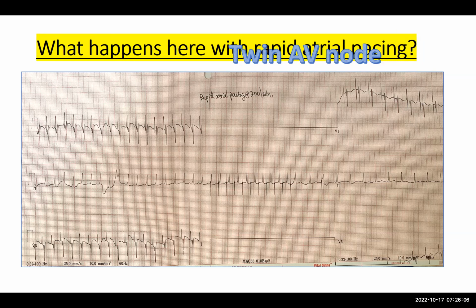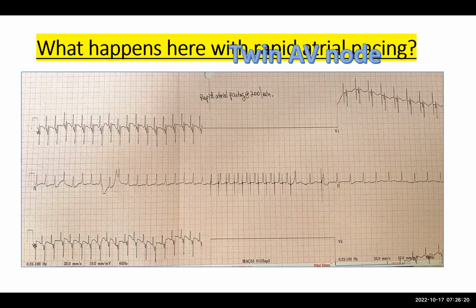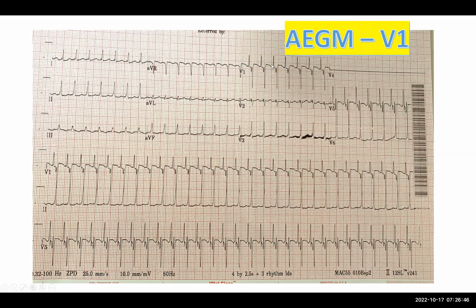Slightly slower, and QRS looks about the same. The PR interval looks different. So this is a reentrant arrhythmia, right? Because pacing should not be able to terminate an automatic rhythm. So this isn't sinus, which it could have been, except we know that it started suddenly. And what we theorized, in retrospect, if we go back to this tracing, is that there is a very long R to P interval here. This is really, really long.